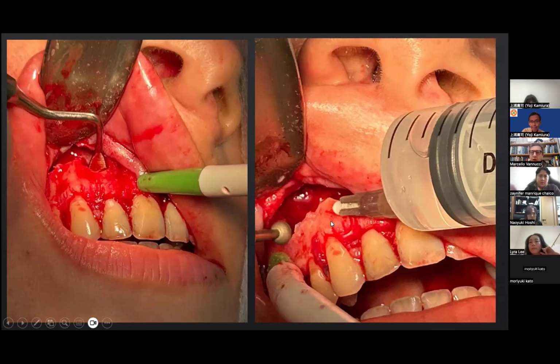So we removed all the lesion, and carefully treated these borders, and made this incision like a periodontal approach for incisions today, not using the papilla, because here there is a very aesthetic problem.